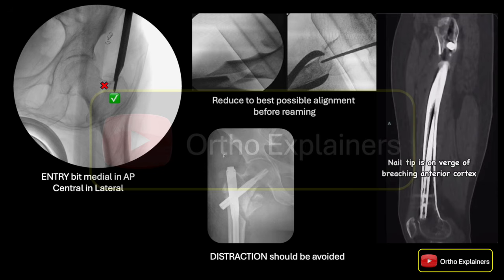And finally, this one's huge. Release traction before you put in the distal locks. You do not want to fix the fracture while it's distracted.